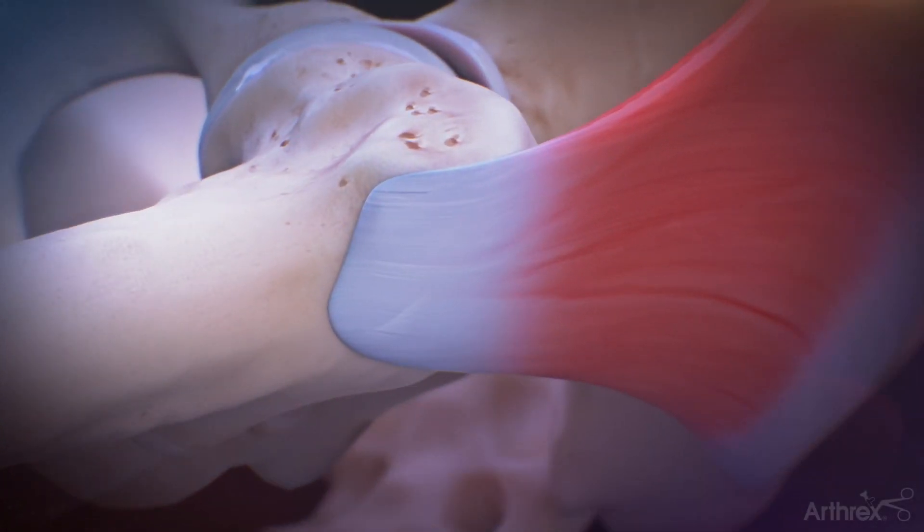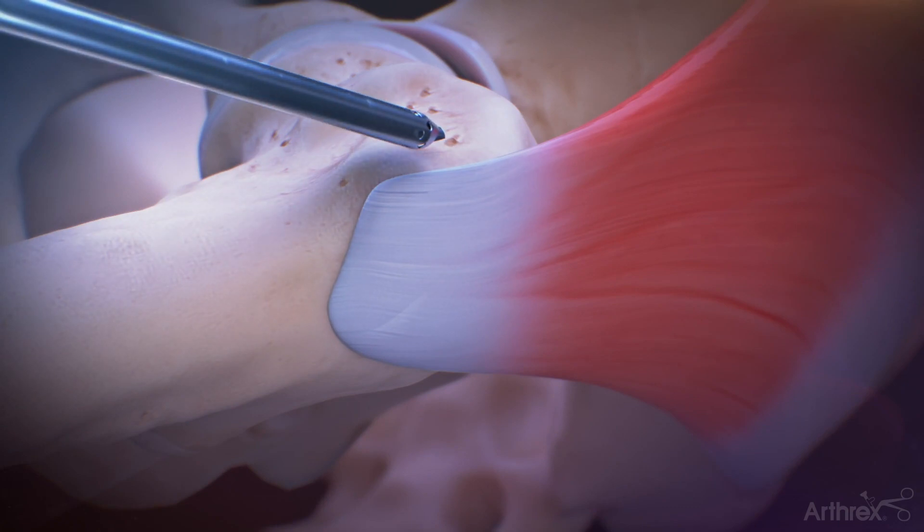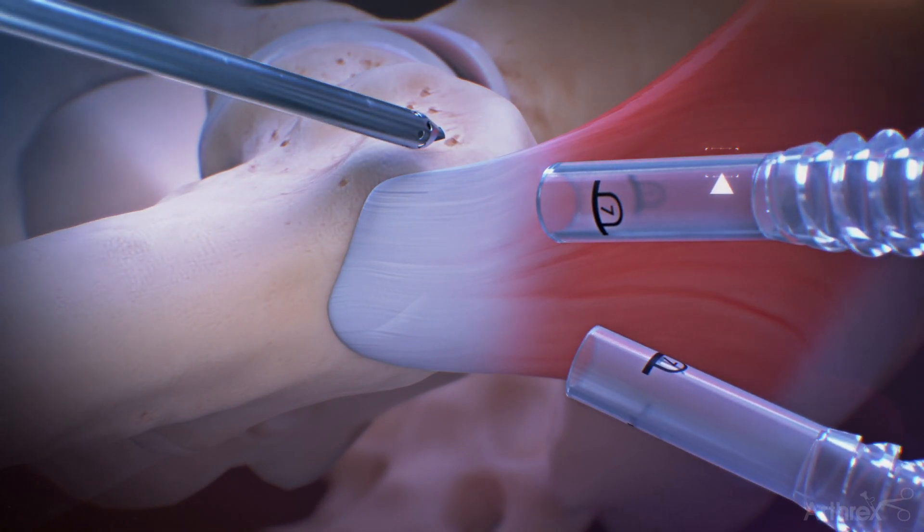Establish a distal anterior lateral accessory portal for viewing and insert two flexible Trimic custom hip cannulas.